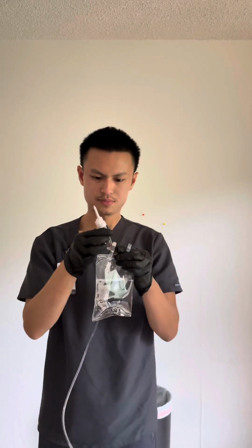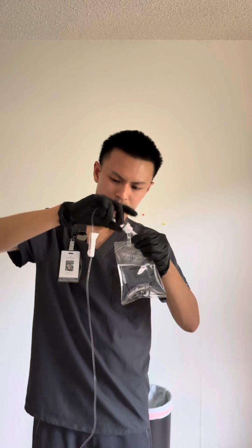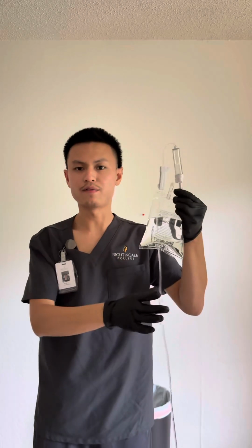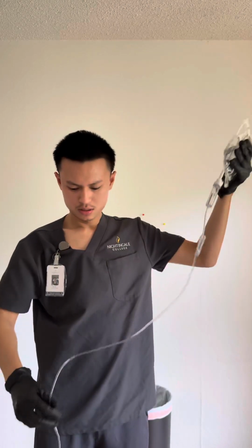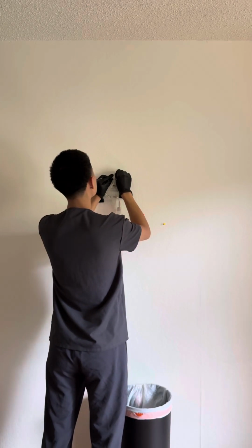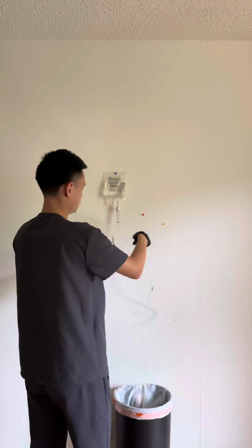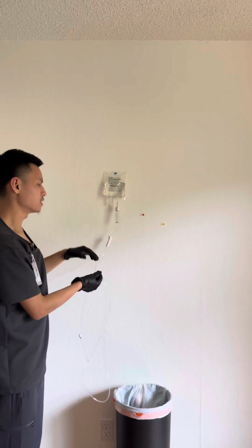I will begin with removing the cap for the fluid bag and the cap to the primary tubing. I will spike it. I will make sure that the roller clamp is in the off position so that fluid does not flow out of the tubing when I flip it over. Now that it is flipped, I will hang the tubing. When hung, I am going to make sure that it is 30 inches above the IV site.